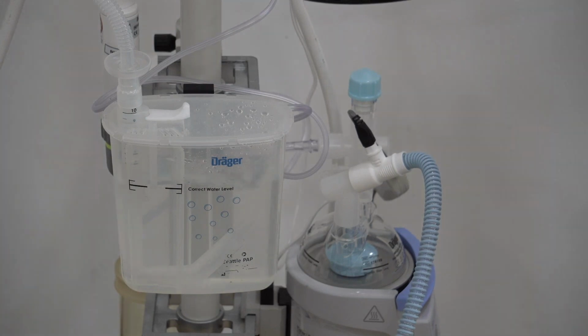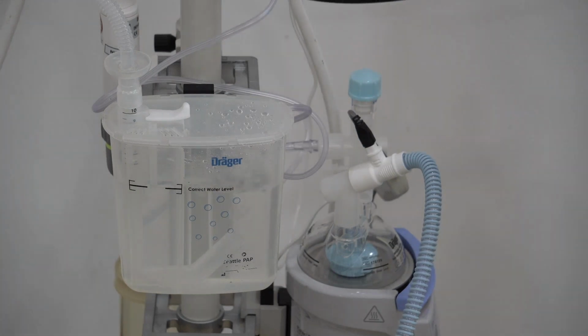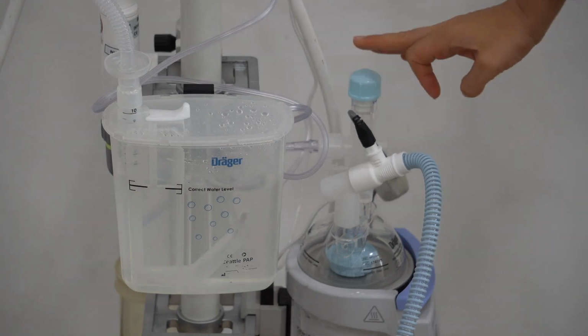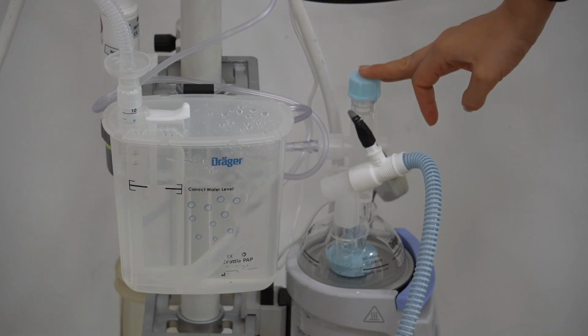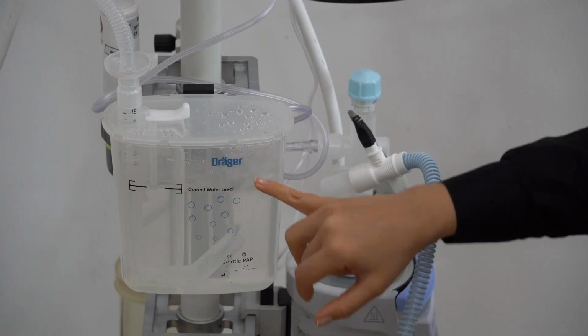Because we know that we're just trying to maintain a stable pressure. Of course, there are cases when the babies fight the system or they grunt or they cough, and the system has enough flexibility to allow the baby to do that, but we will never deliver excessive pressures to the baby. That's why we have the safety valve that opens at 17 when the pressure reaches higher than 17 millibar or centimeters of water. Also, if we look at the system, it's quite simple.